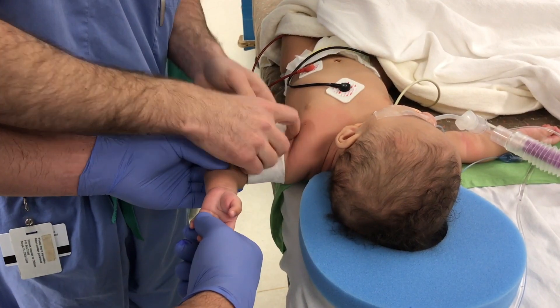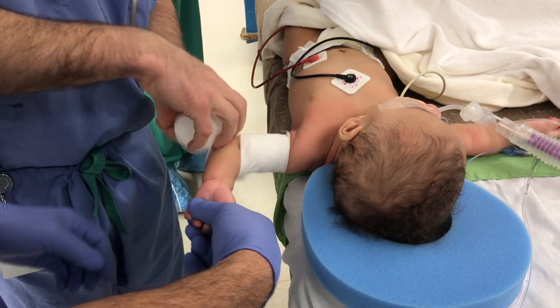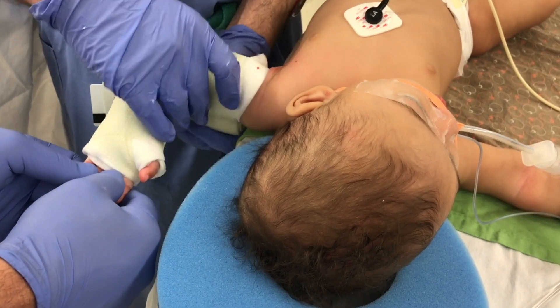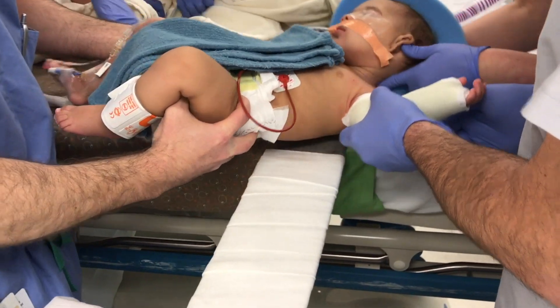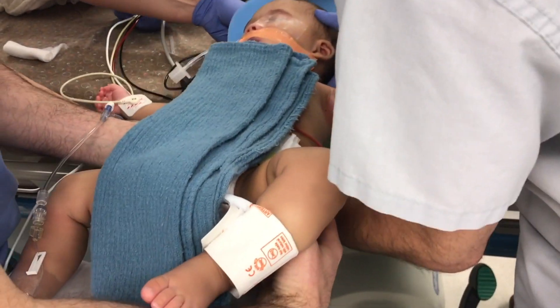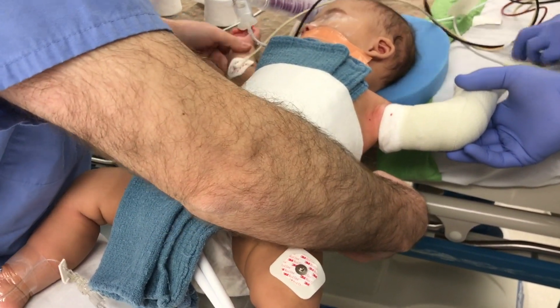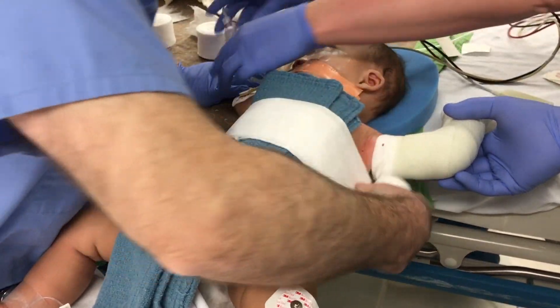A long arm cast is then applied, making sure that it is not too high on the arm to impinge on the axilla. Once the cast is hardened, the patient is transferred to a spica bar with towels placed underneath the cast to allow for expansion of the chest. Care should be taken so that the cast does not impinge on the thighs or the axilla.